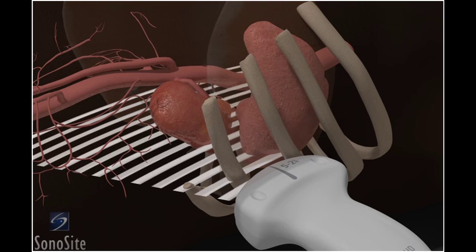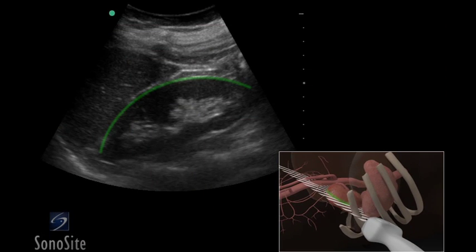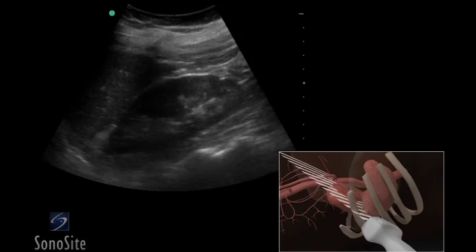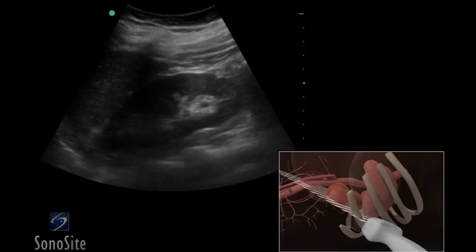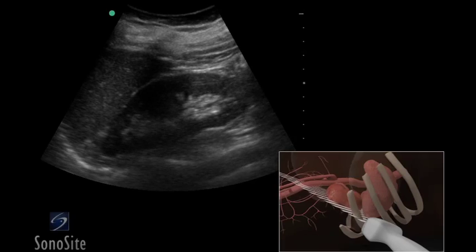Once the kidney is identified, the transducer is slightly rotated to adjust for the oblique orientation of the kidney. The transducer is then swept from anterior to posterior to image the kidney parenchyma, which will appear hypoechoic when compared to the spleen.